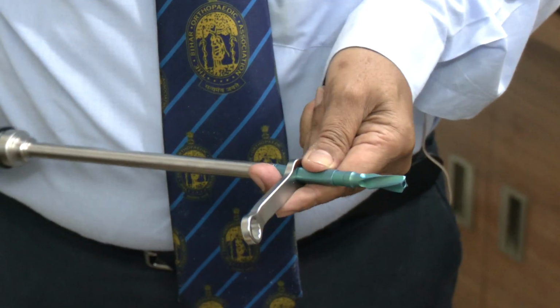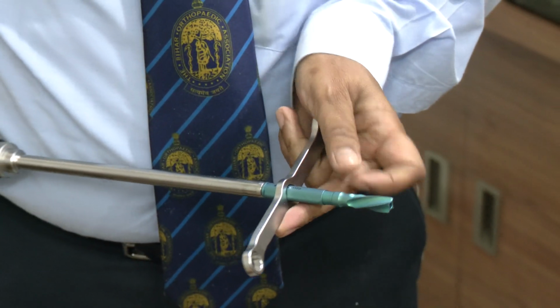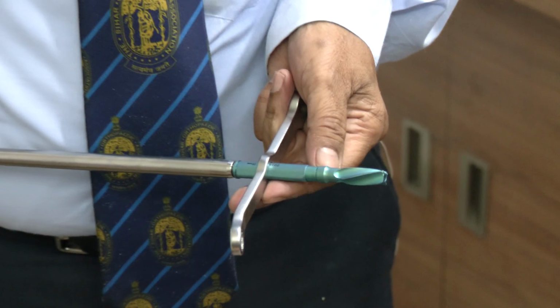Once I remove this screwdriver, you can see that the gap here keeps on becoming less and less.